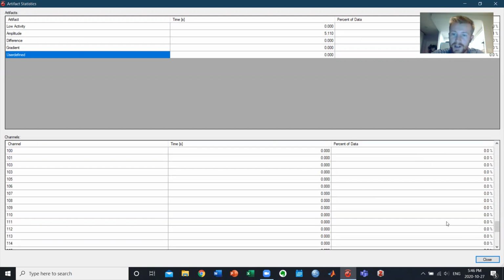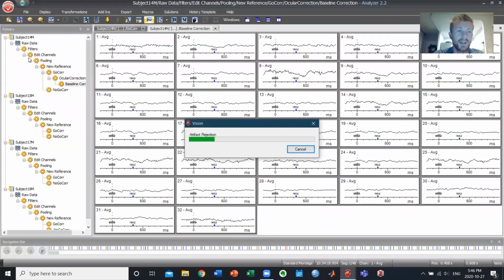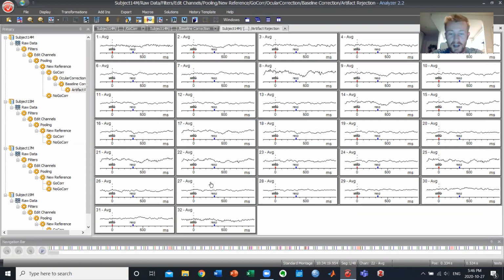So if you saw maybe one channel had like 15, 20% of the data being removed, then what I would do is probably go and look at a few different participants. And if you saw that for a few participants in a row, there were a few channels where 20% of their data was being removed. Let's say we have 50 trials. Let's say maybe like 5 trials were being removed from a few participants. Then you would maybe want to consider making your criteria less stringent so you can keep more of those trials. And of course, you can just list this in your method section and kind of leave it up to the reviewers, I guess. So now we see artifact rejection was there.